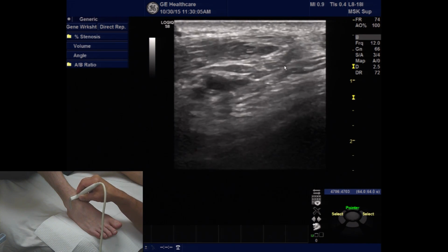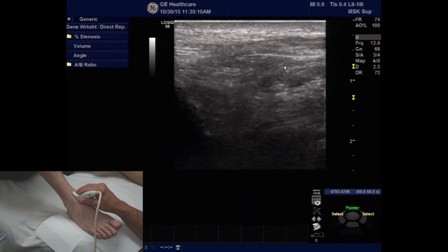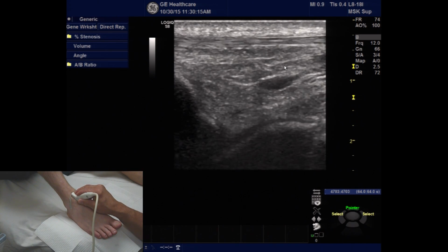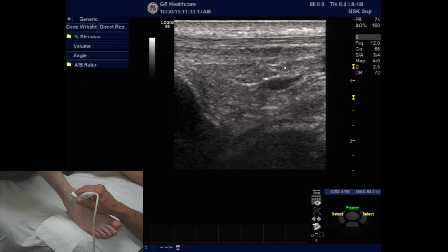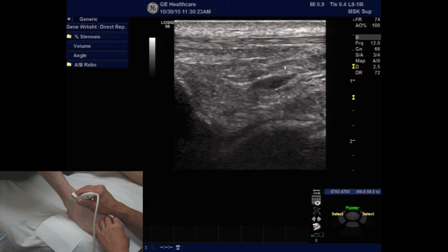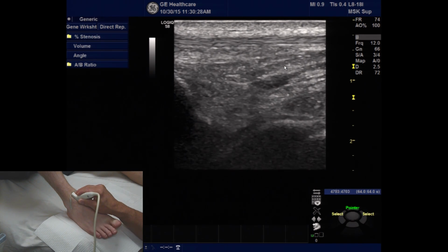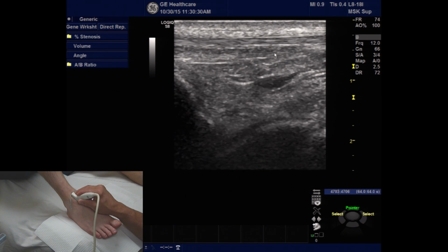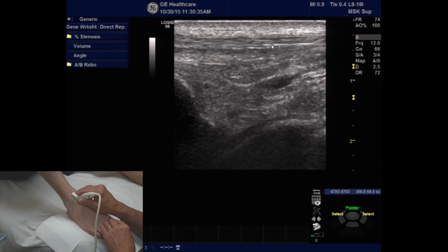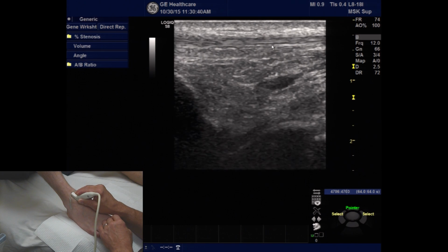Continuing into a long axis view, once again we're going to rotate the transducer into its long axis. Now it can be confusing which tendon we're looking at. Once again, I'll offer the dynamic maneuver that helps us locate which tendon we're evaluating. By moving the large toe back and forth, we can actually see the tendon and the muscle of the extensor hallucis longus slide back and forth, assuring that that is the tendon of evaluation rather than the tibialis anterior.